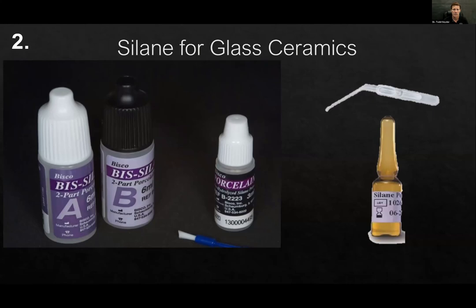It's one-time use. Now, if you're someone who's doing a number of cases and that little vial doesn't do enough for you because you have more teeth than that little vial offers, that's why most of us typically use what's on the left-hand side, which is what you're seeing here from Bisco.